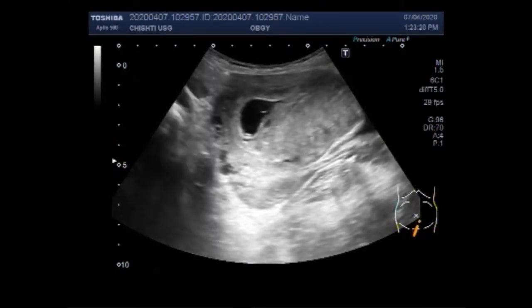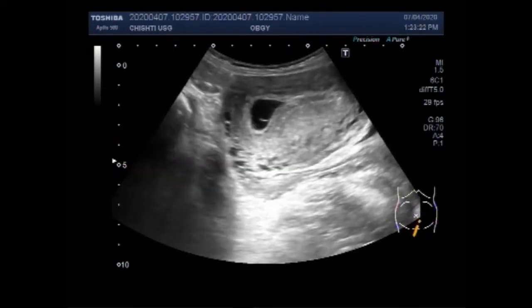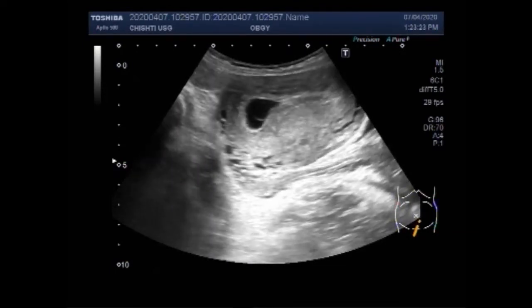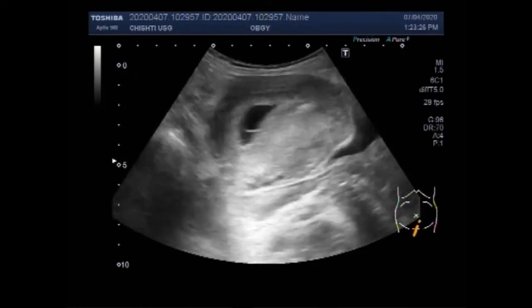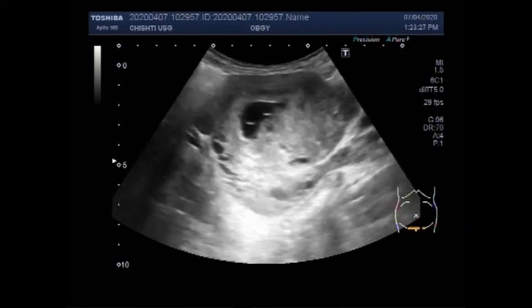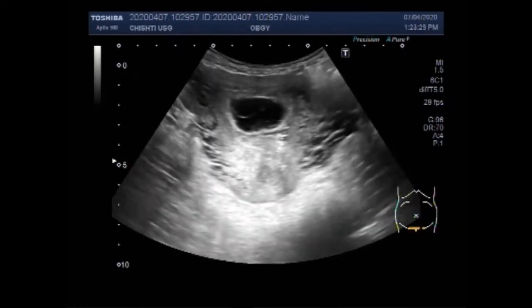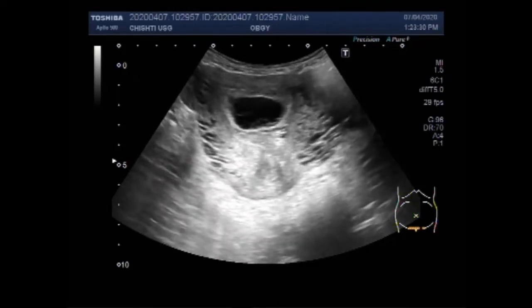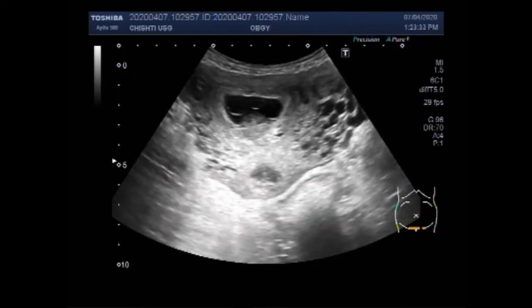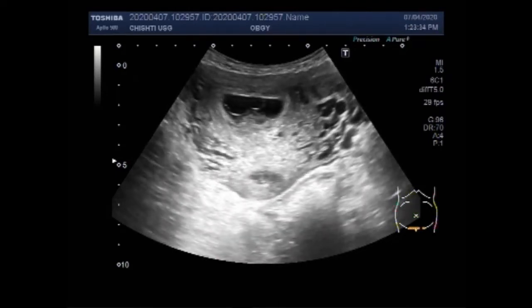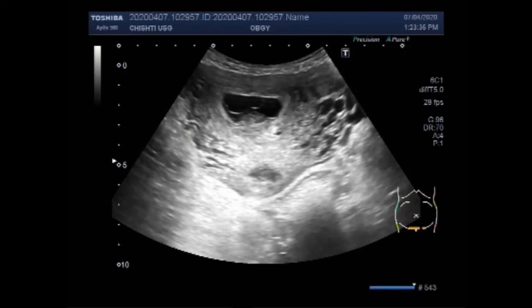In blighted ovum, the gestation sac forms and grows; however, the embryo does not develop. Blighted ovum is also known as anembryonic pregnancy. In the United Kingdom, miscarriage is defined as the loss of an intrauterine gestation sac with a diameter greater than 25 mm and no yolk sac.